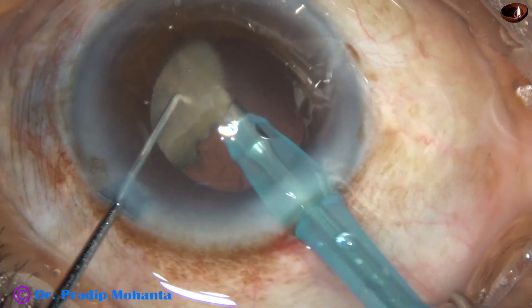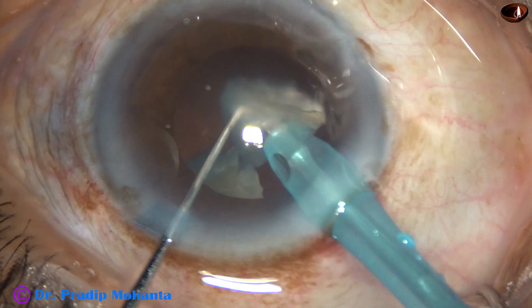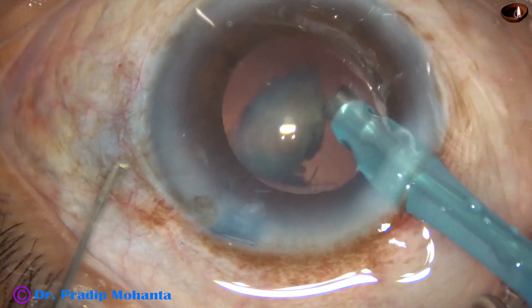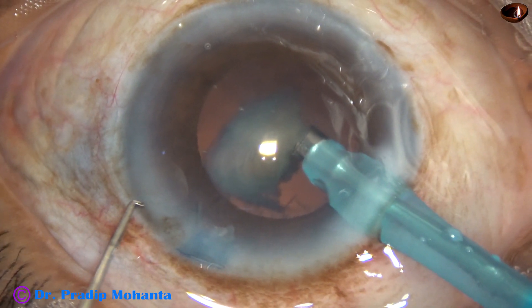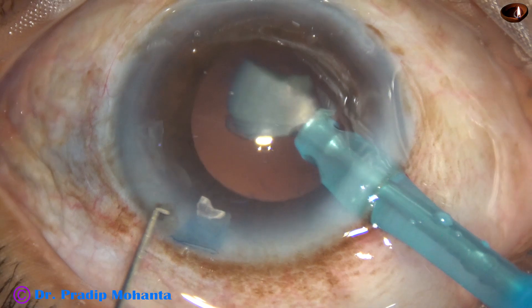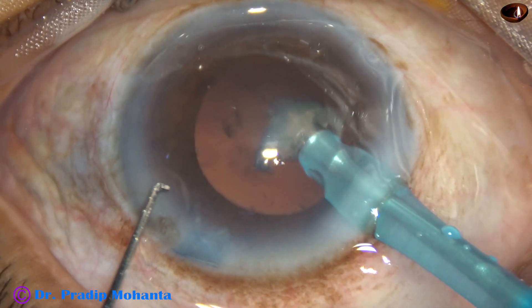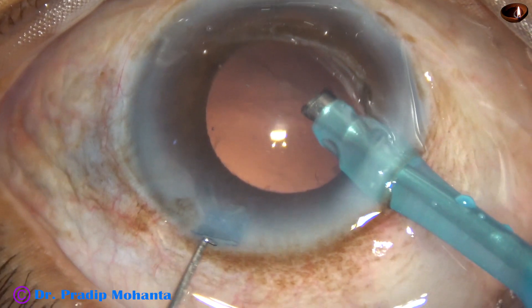This is the last nuclear fragment. It is subdivided into two pieces and emulsified. For this last small piece, the vacuum is reduced to about 150 mmHg and emulsification is carried out very slowly. Care is taken so that there is no surge and the posterior capsule does not come upward. Very slowly this piece is emulsified.